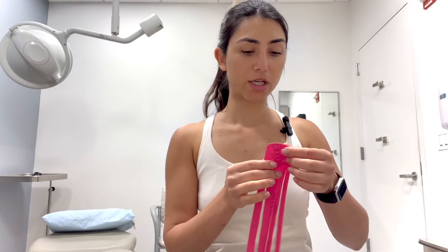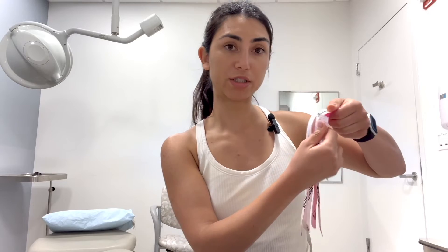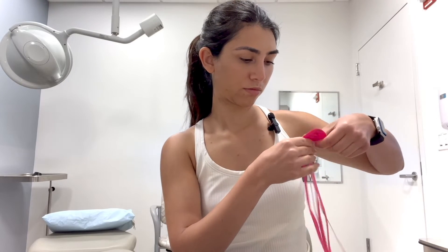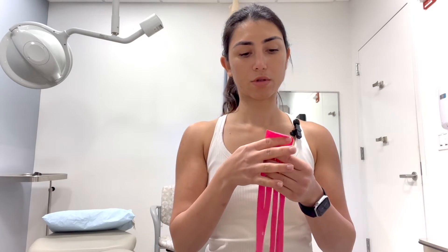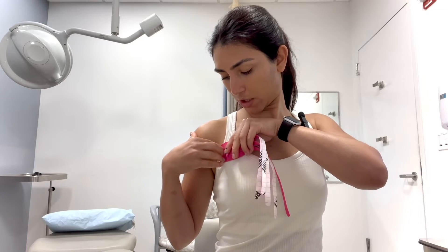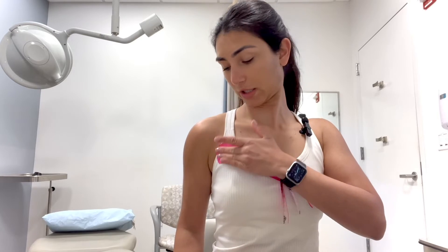We're going to take the shorter one, which goes across the chest. We're going to tear the back of the tape where the strip starts and peel it off. We're going to anchor it directly to our skin on the unaffected side, right in front of the armpit, and rub it in so it can stick well.